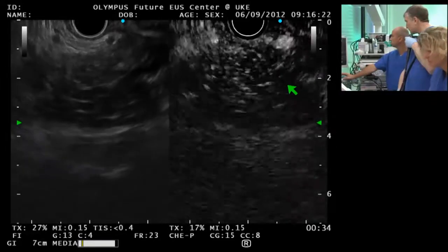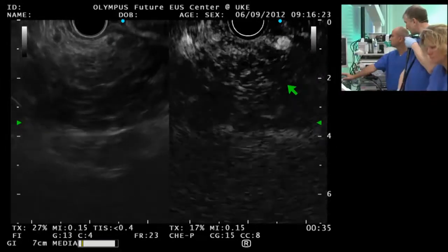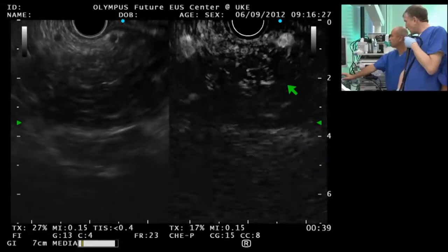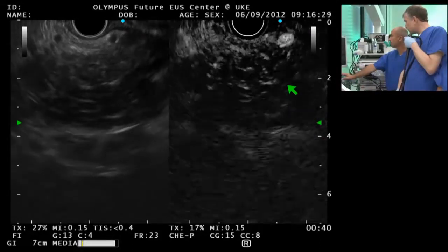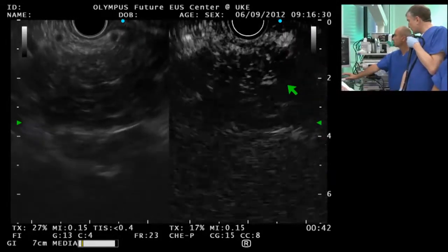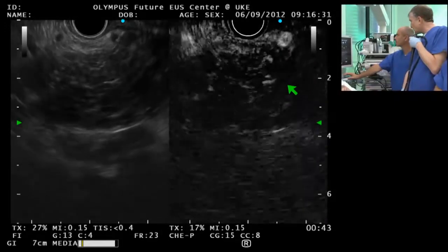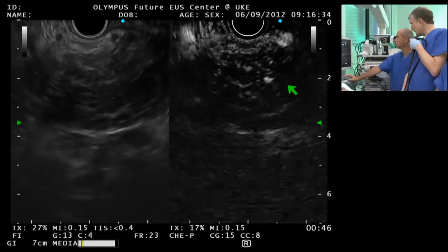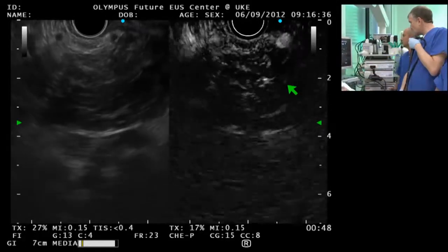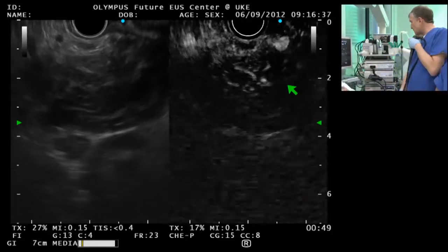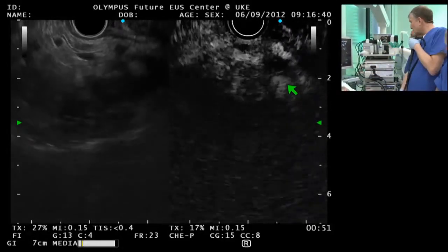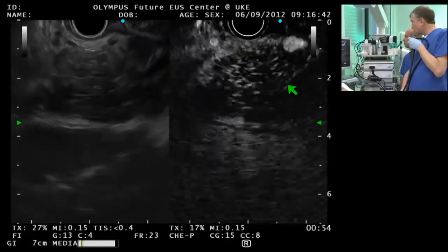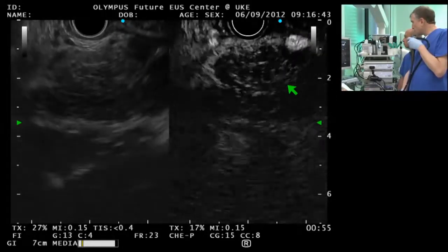So we didn't have a tumor suspicion by linear. I was not sure with radial. So I think there's a further piece of evidence to say that malignancy is very unlikely given also the other facts — one year history and so on. So there's no need to puncture this area. I agree with that.